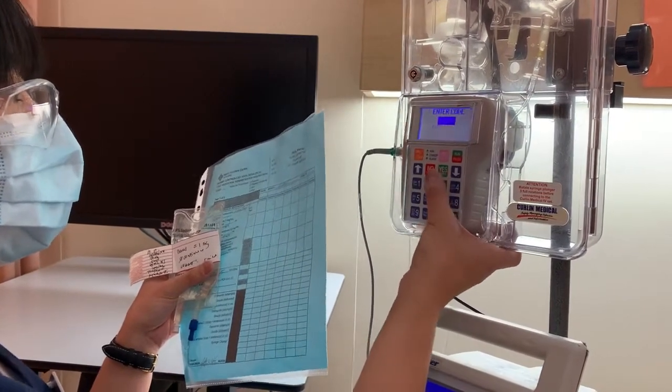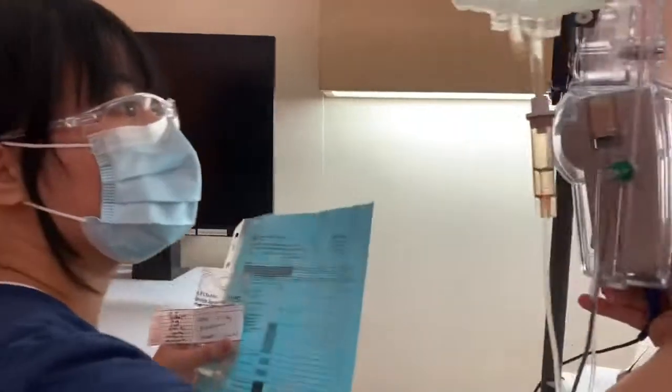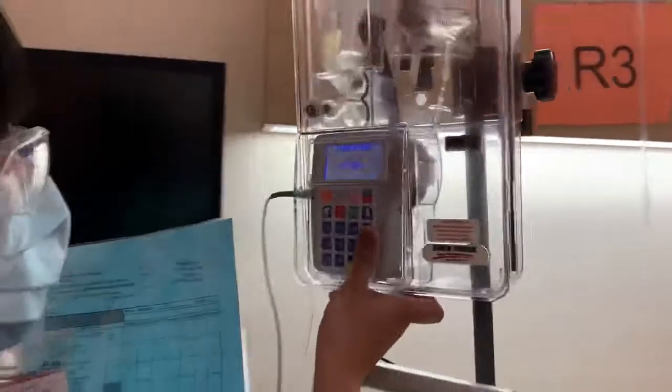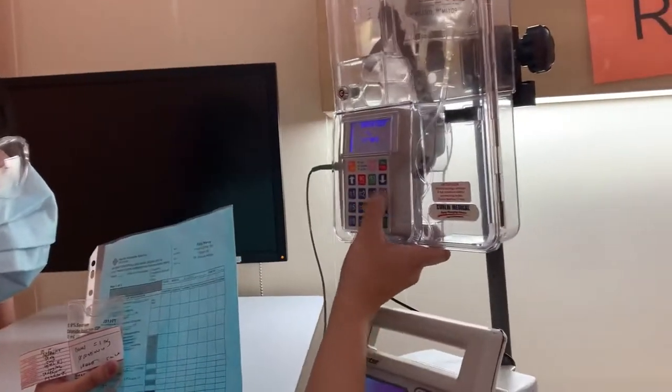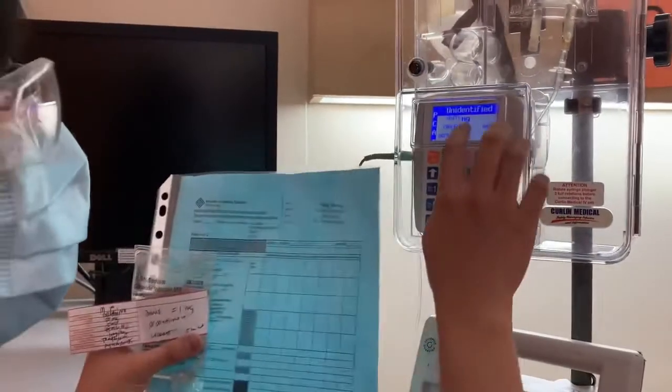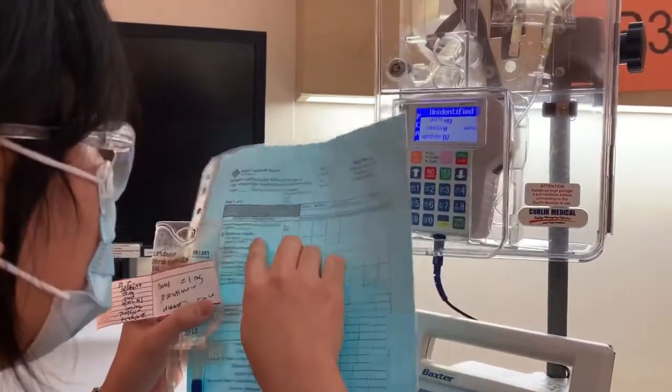Okay, so program, yes, and the code would just be at the back, so that would be 94629. It's just backwards. 94629, and there we go. So we made sure that the unit is correct. It's milligrams. It's milligrams in here as well.